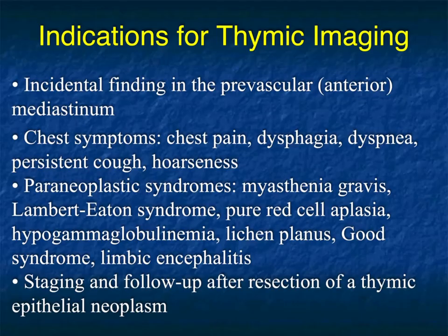Now, in terms of the next topic, I'd like to speak more about the thymus gland, okay? So we talk about the thymus under those 3 T's and an L. The thymus is in every patient, right? Its size will vary. It's larger in children. It begins to atrophy over time. Usually patients over age 25, you don't see much of the thymus.